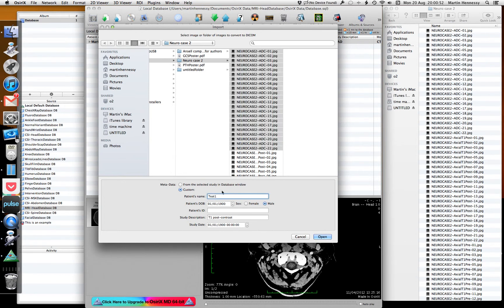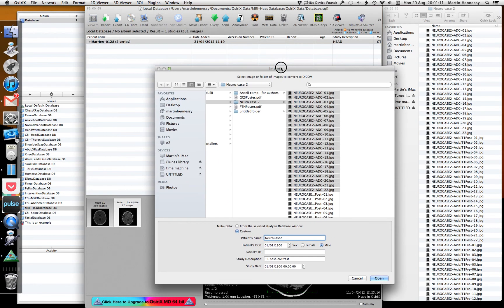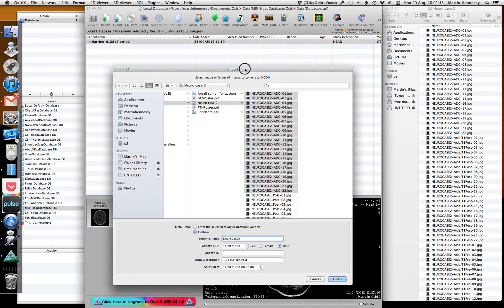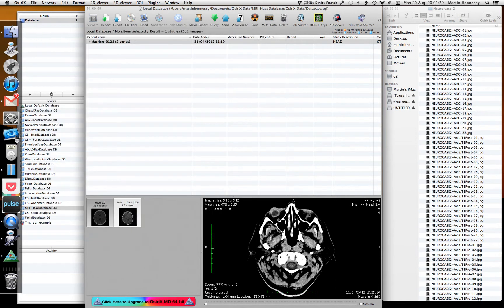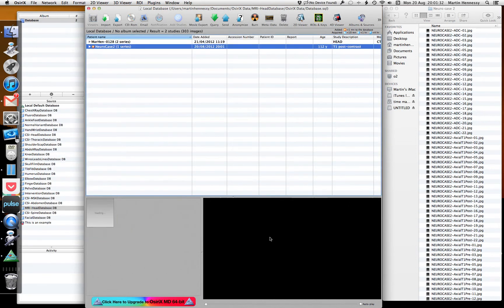There's some text in here from previous testing. I'm going to call the patient 'neurocase2'. The patient ID I normally leave blank. The study description is 'MRI Head'. The important thing is that you've got the series name within the actual filename — we'll see why shortly. I'll open that. Because these are just JPEGs rather than DICOMs, they copy in extremely quickly.